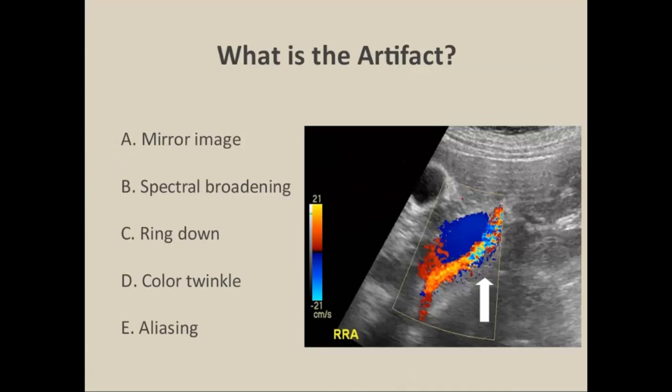Our first question: can you name this artifact? The arrow is pointing to the renal artery. Is this mirror image, spectral broadening, ring-down artifact, color twinkle, or aliasing? If you understand artifacts, most of these don't fit. Color twinkle is typically seen with calcification — usually in the setting of a renal mass or calcification, not a long segment of abnormality. What we see here is aliasing occurring within the artery at the center of the stenosis.